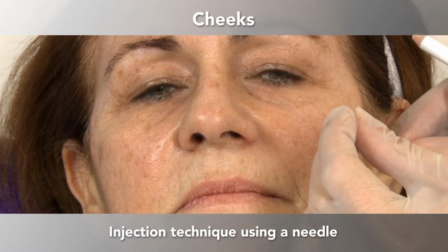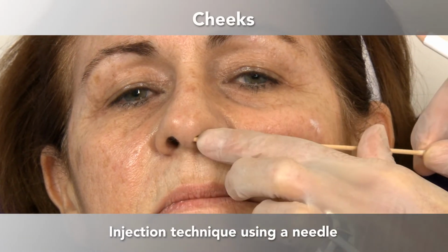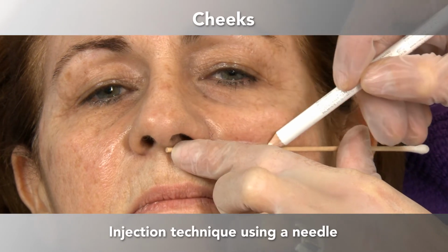Cheeks. Injection technique using a needle. Belotero Volume.